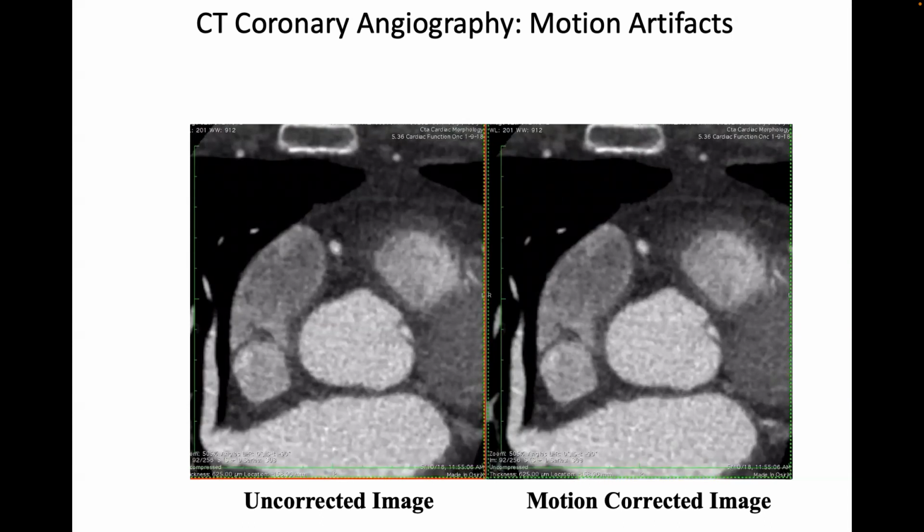And you can do it that way. The way this works, this algorithm is very similar, in most aspects, to an algorithm called snapshot freeze. You can look that up, and it's a really cool algorithm. We wrote a very detailed paper on it in Medical Physics.